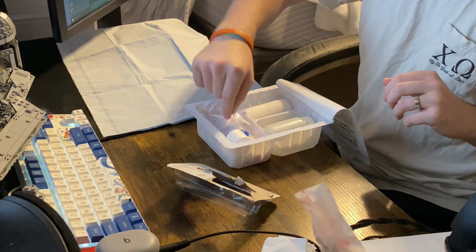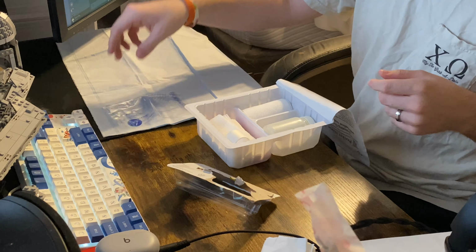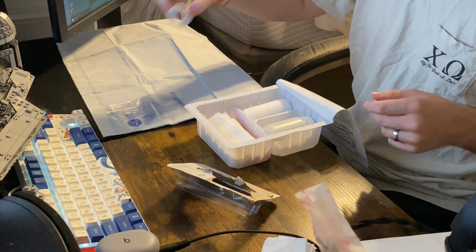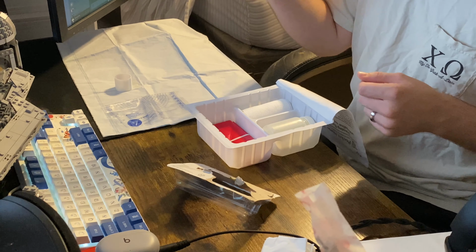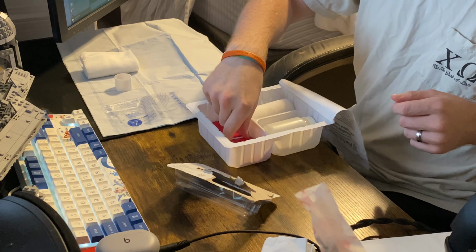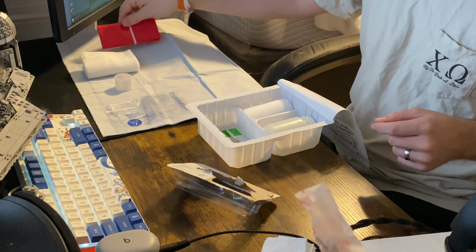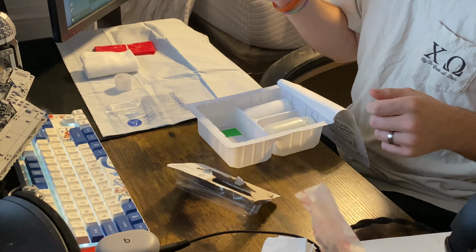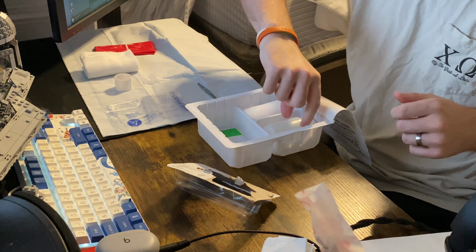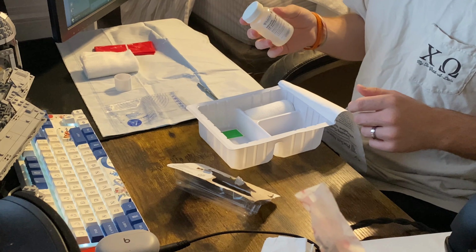So we have our measuring tool that we can use in a second to measure that wound, tape for putting the bandage on, gauze for saturating the wound, a biohazard bag to remove and to dispose of anything as necessary, scissors to cut off the previous bandage if needed, and our normal saline solution.